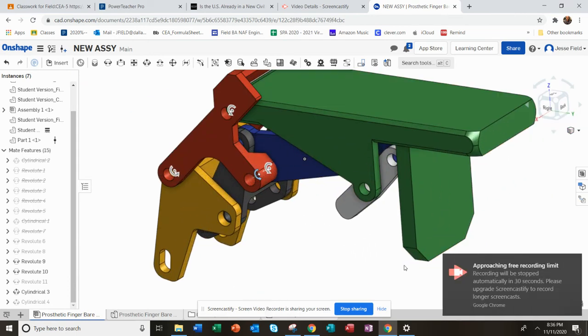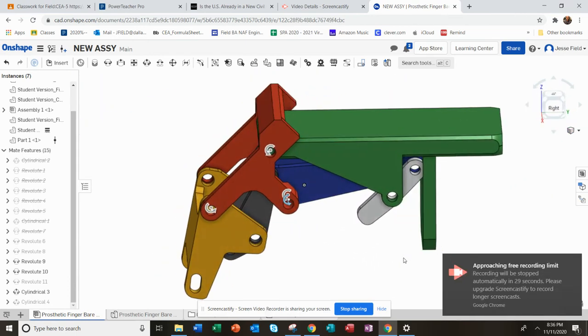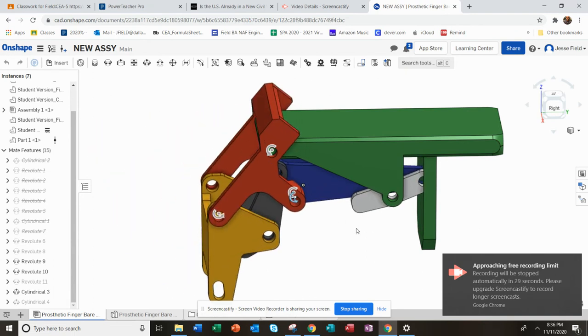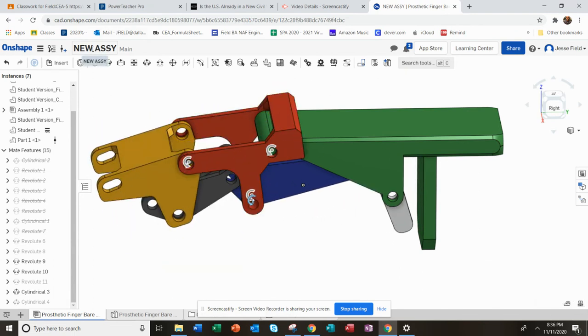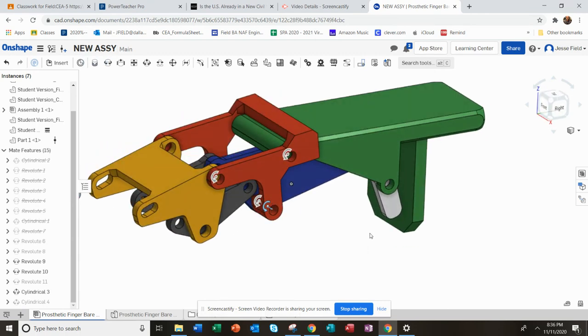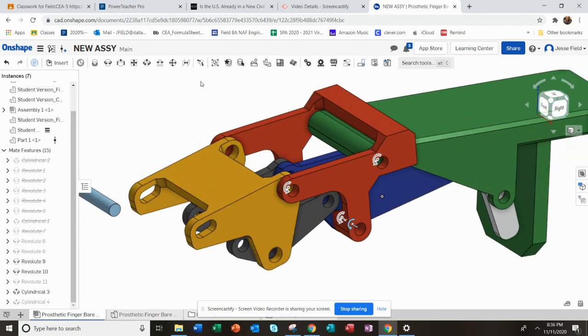So what I'm looking for is that from you guys — try and get it to this point. What you're going to do is turn in your version with your name and 'prosthetic finger assembly,' and actually upload that file to today's assignment. And then lastly, I'll position that end roller.